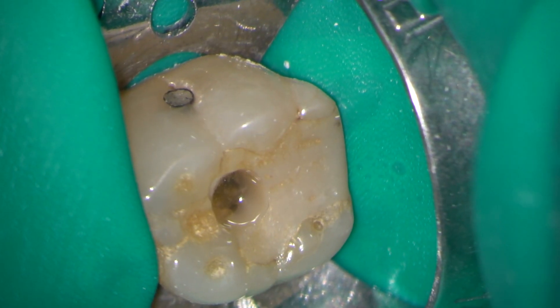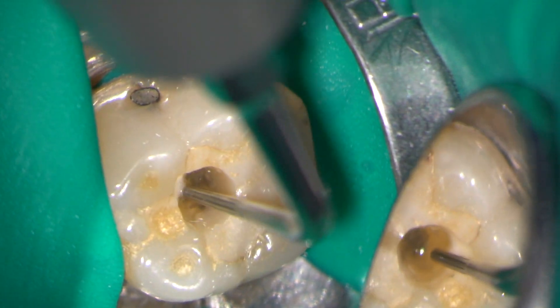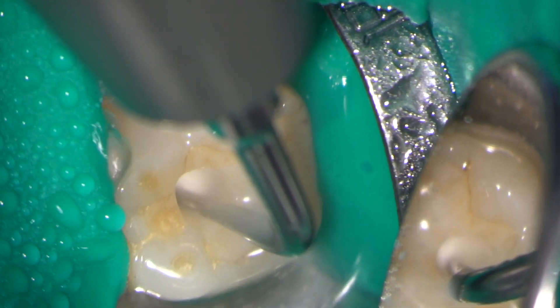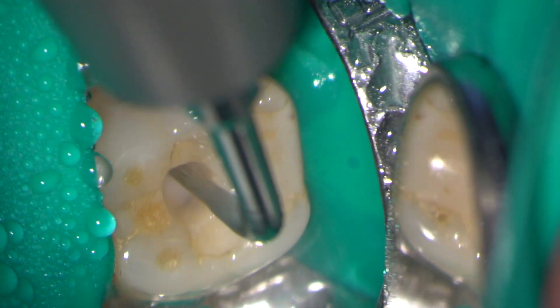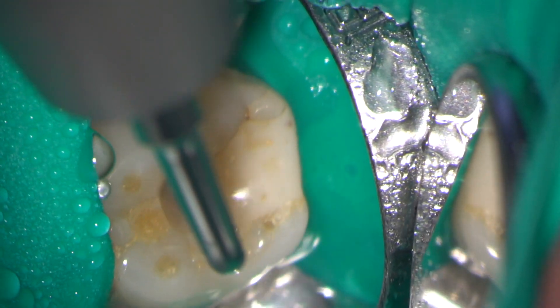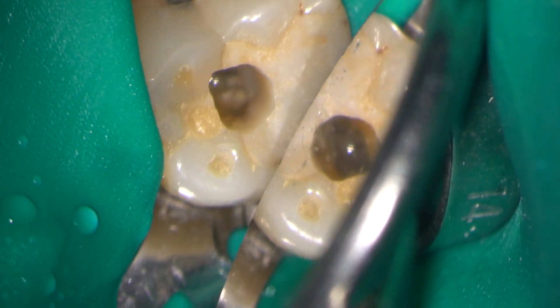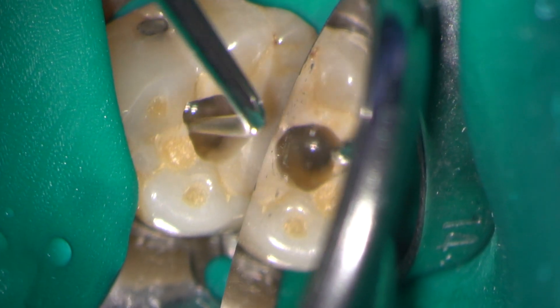The pulp chamber had lots of dystrophic calcification in it, and I'm going to remove this using an ultrasonic tip, the Startex 3. Here I'm exploring the floor of the pulp chamber with an endoprobe to see if I can dislodge any further calcifications.